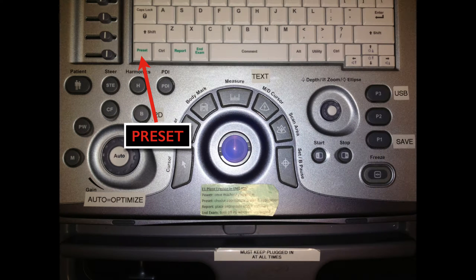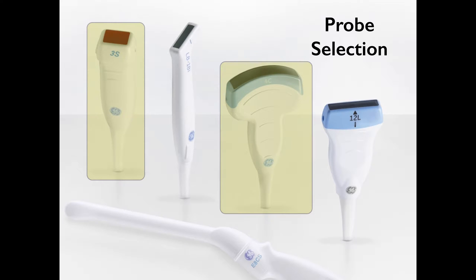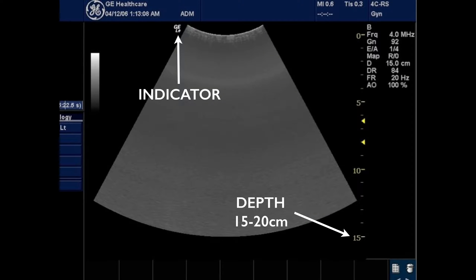For the ultrasound machine, click the preset or exam button and choose either the FAST scan mode or abdominal mode. The transducer you want to select is either the phased array probe or the curvilinear probe. I prefer the phased array probe. The indicator on the screen should be on the left side; if it's on the right, you're likely in cardiac mode.